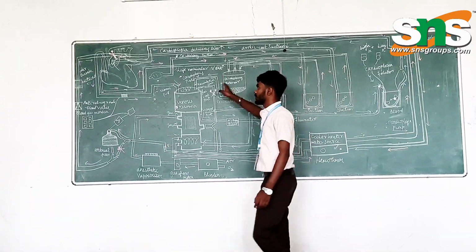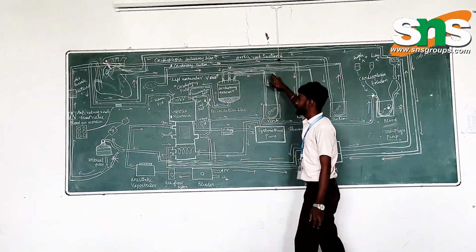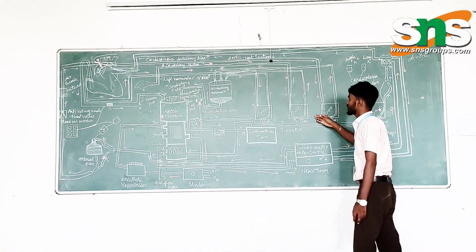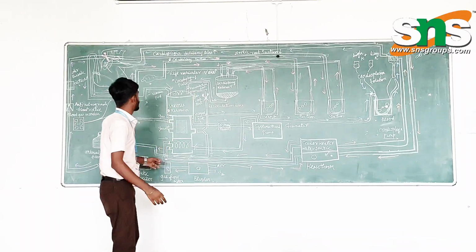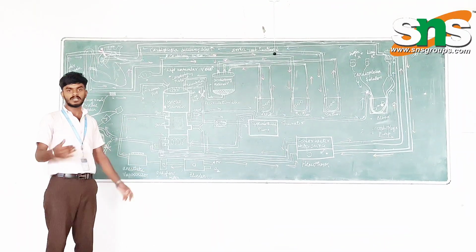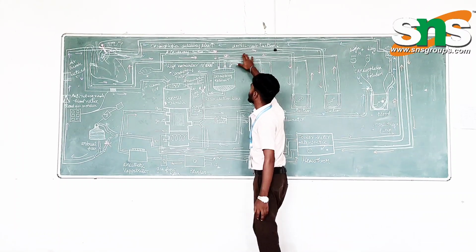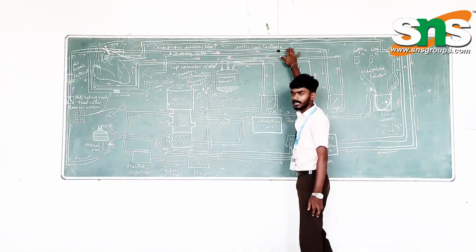Next, deoxygenated blood from the left ventricle goes through the left ventricle vent line and reaches the cardiotomy reservoir and venous reservoir. Next, suction. First suction draws the pericardial fluid and blood due to the sternotomy. Next suction draws the debris present at the aortic root with the help of the aortic root suction line.